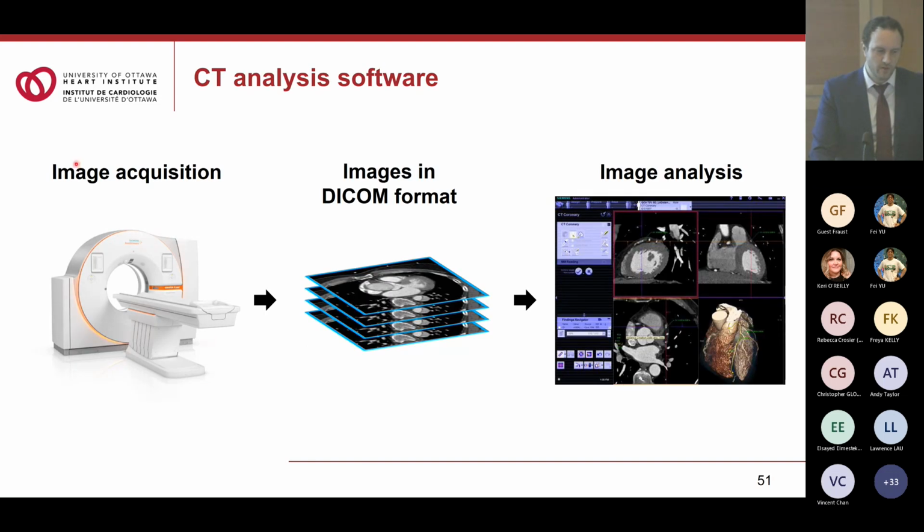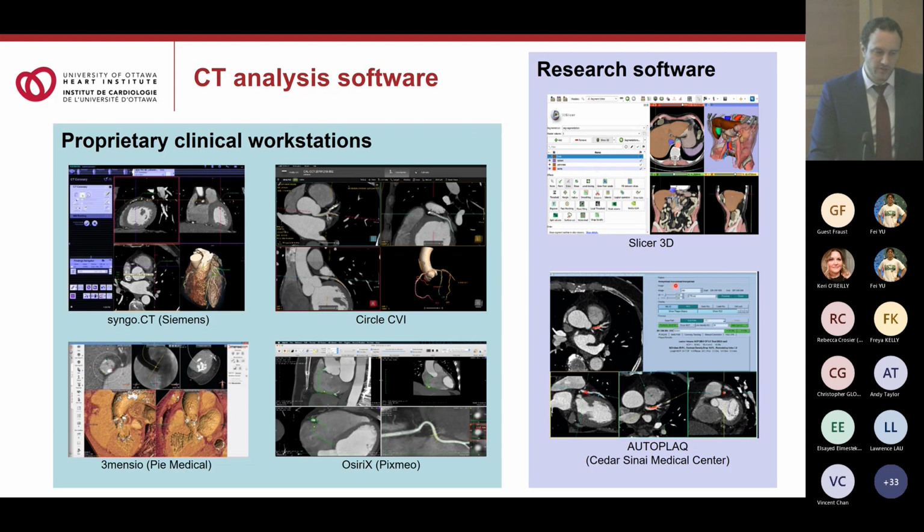So as we know, when we acquire a CT scan, images are stored in DICOM format and then need to be imported into a workstation in order to be annotated and analyzed. There are several of those workstations that are clinically available. They're quite user-friendly, but they're all proprietary, and the format they save data into is really hard for researchers to use.